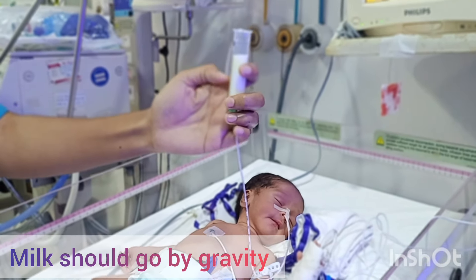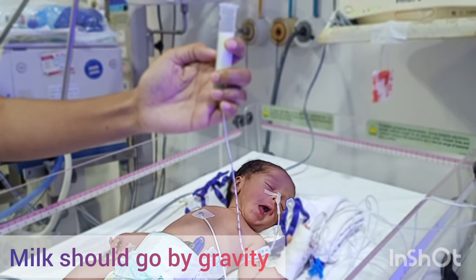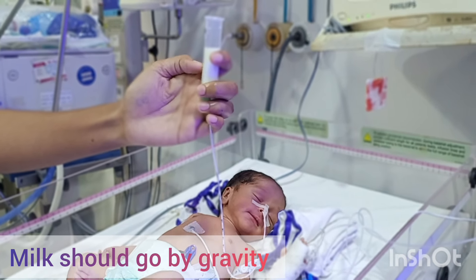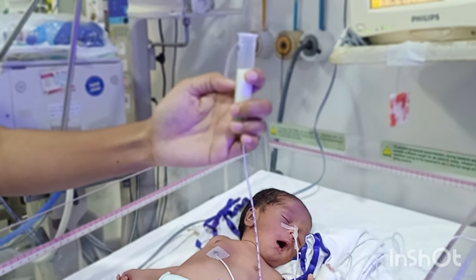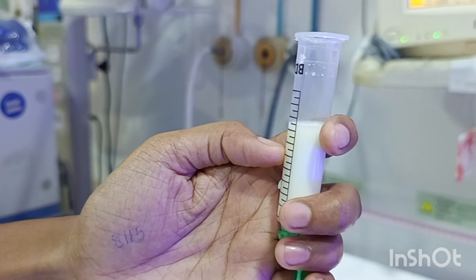We have just let go, and now the milk is gradually going through the tube inside the baby's stomach under the action of gravity. We are not using any plunger — we do not want to push the milk inside the baby. The milk will gradually go inside the baby under the action of gravity. We should keep the syringe about 10 to 20 centimeters above the baby.